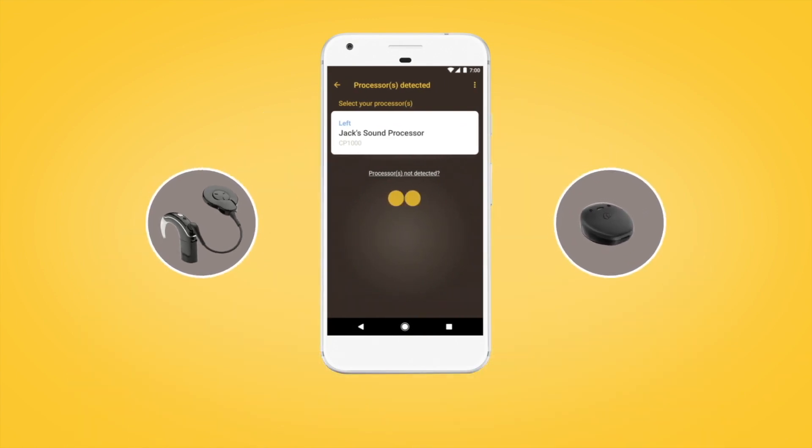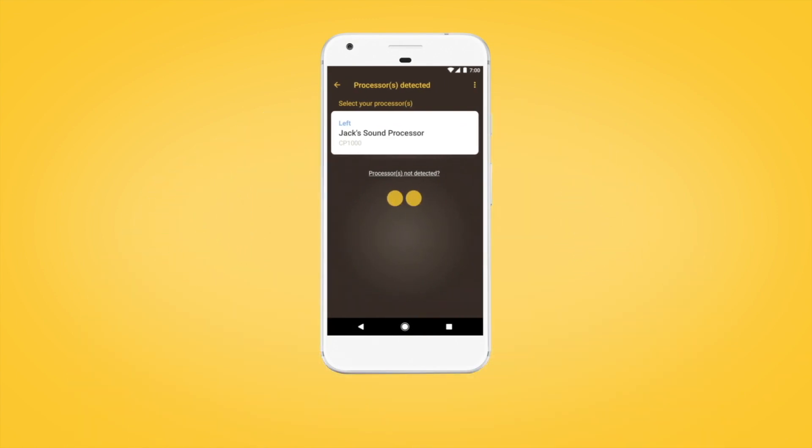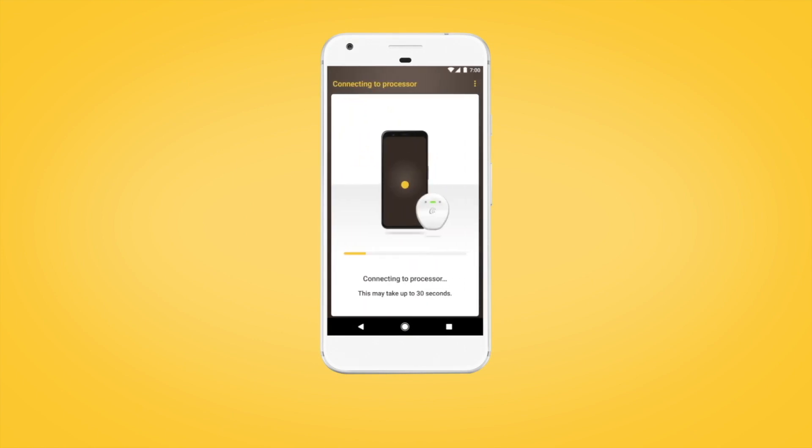When your sound processor is displayed, select it to begin pairing. The pairing process may take up to 30 seconds.